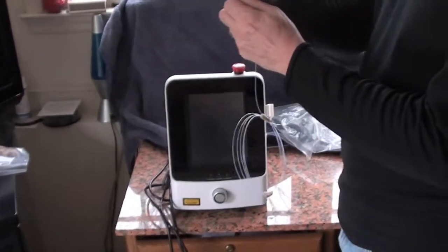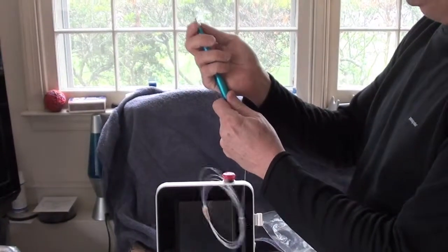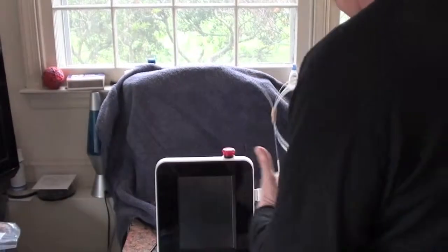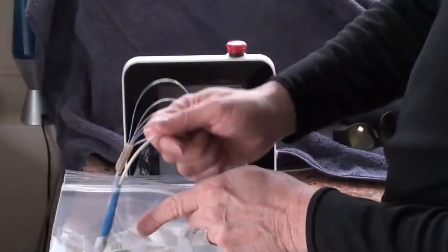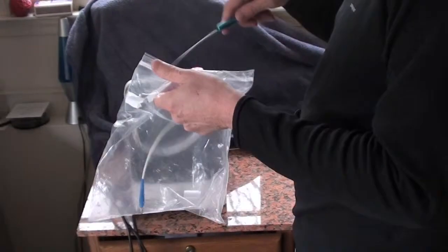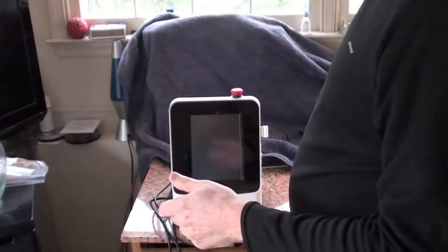You always store your handpiece fiber inside. You unhook the top and you store it. It's like a turtle putting his head in the shell, and then you store it in a Ziploc bag. It's that simple to do. These fibers do not break unless you step on it or cut it. This is the simplest way we've been using for years.